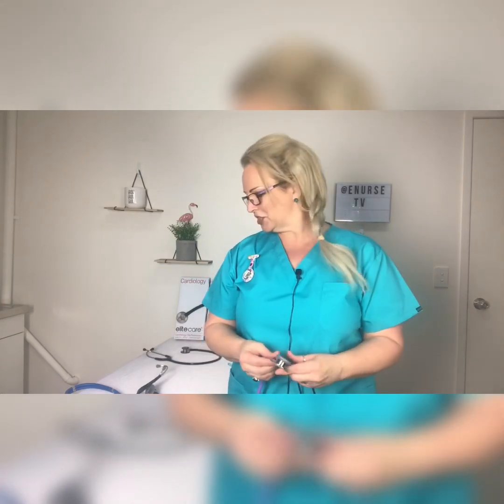However, cardiology stethoscopes can also be used for all other purposes, just like a regular stethoscope. The regular stethoscope is used for auscultation and blood pressure, auscultation of the respiratory system, and the gastrointestinal system. So the main distinguishing feature in a cardiology stethoscope versus a regular is the chest piece.